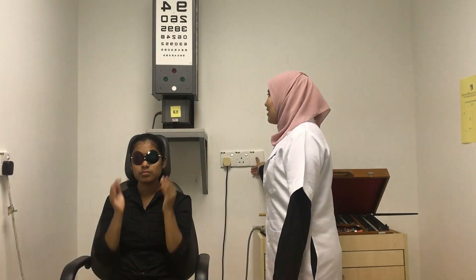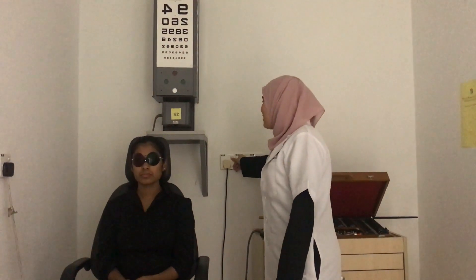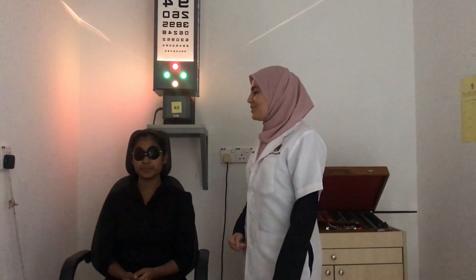When performing this test, you must make the room dim, then open the Worth 4 Dot target. Ask the patient how many dots they can see: 'How many dots do you see?'